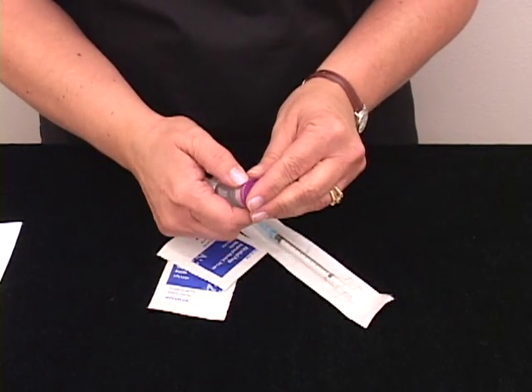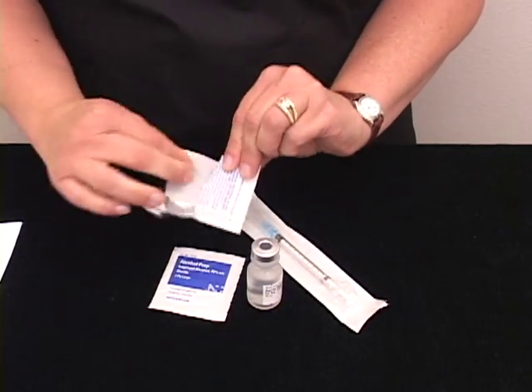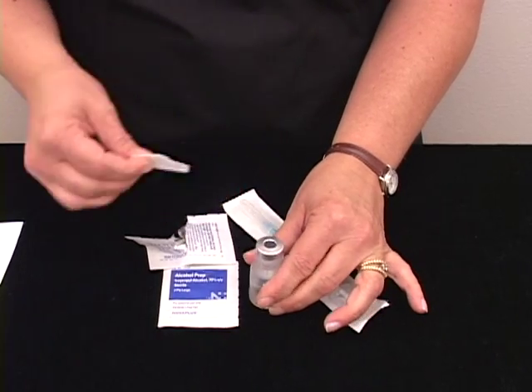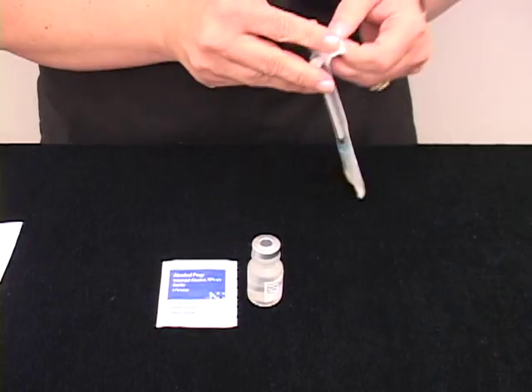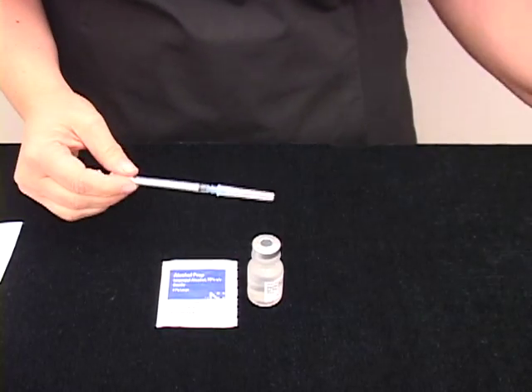Remove the lid from your vial of medicine. Scrub off the top with your alcohol swab. Open your syringe, tighten your needle, and remove the cap.